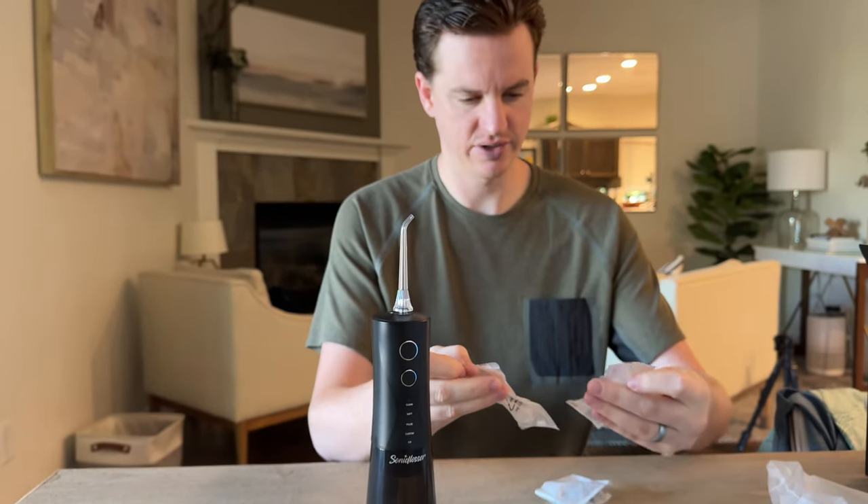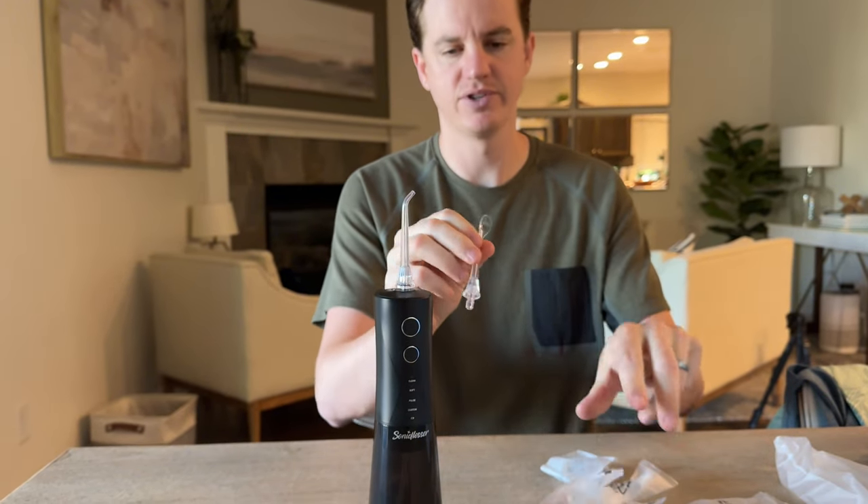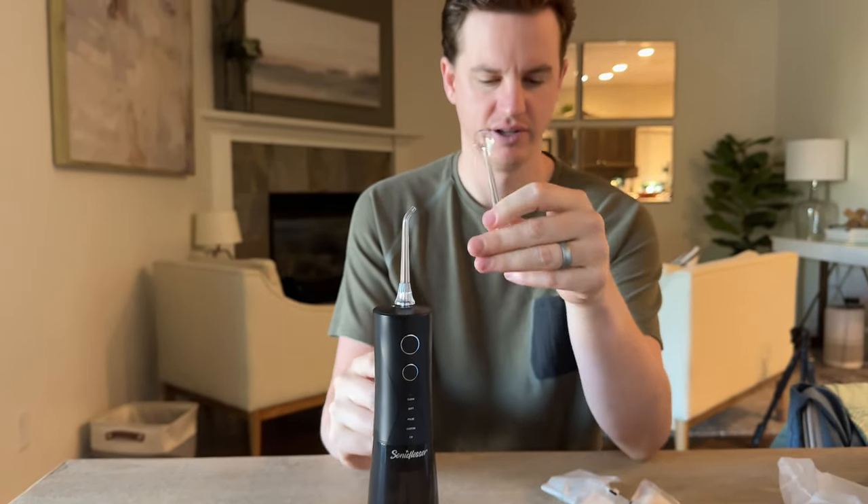And then it looks like there's also a few different ones. This one looks like it's for a tongue cleaner.